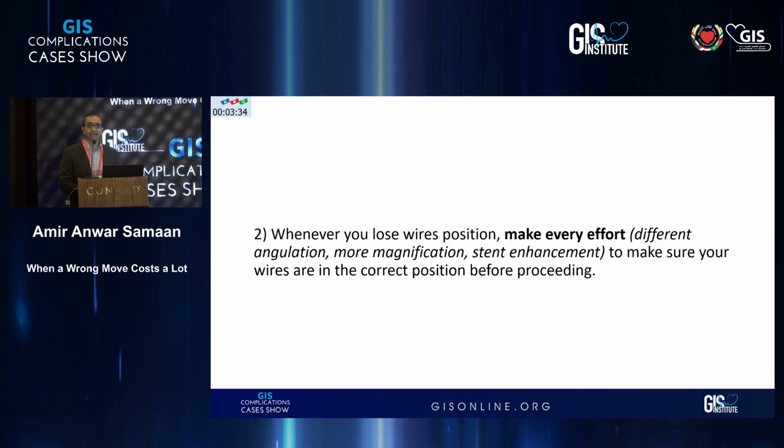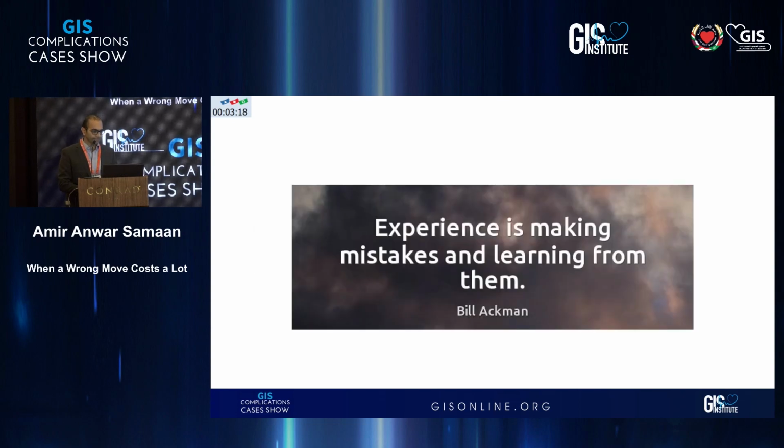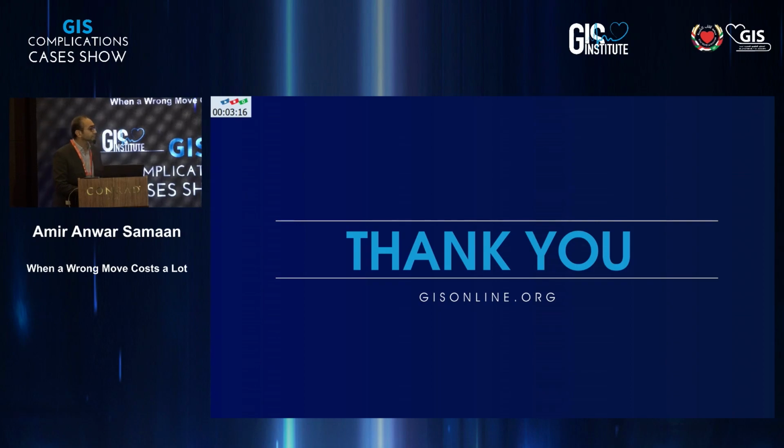And the second simple lesson: whenever you put a stent and you lose the wire, after reintroduction of your wire, please make sure that you are in the correct position before proceeding with any other devices. Thank you.